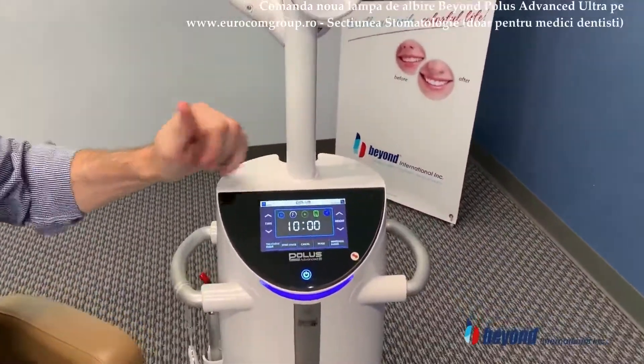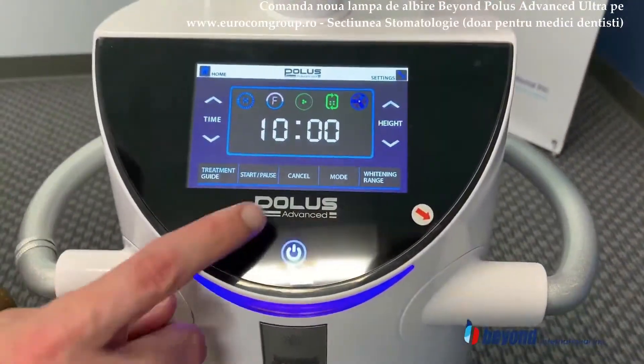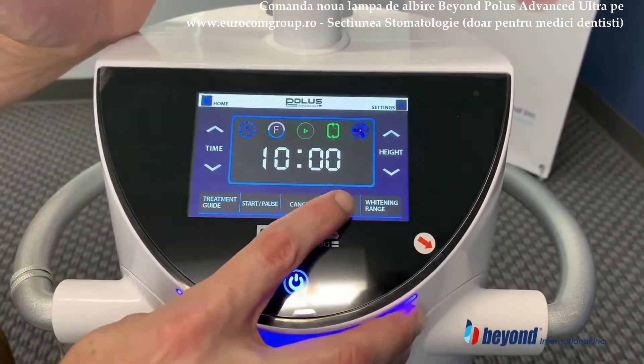As you look at the screen here, to the left this is going to be the high, medium, low settings. I'm going to show you the different modes: low, medium, high.